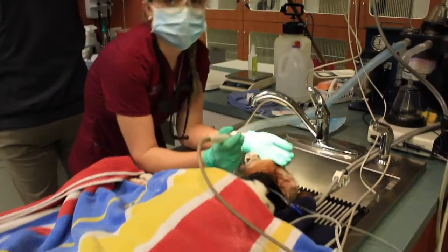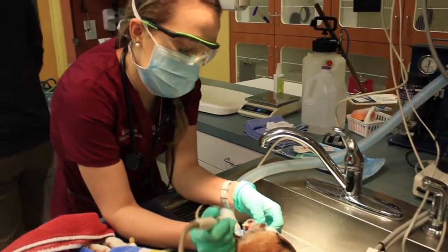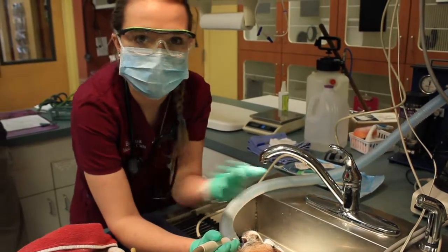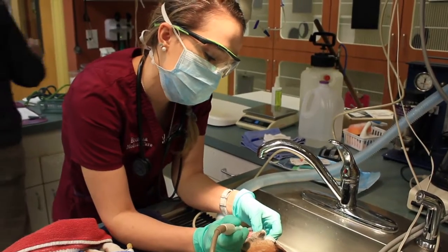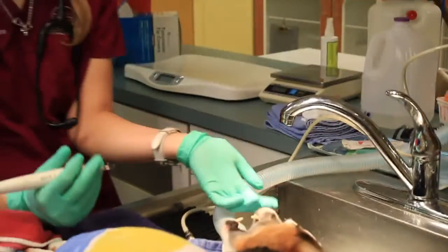I'm scaling each and every tooth just like your dentist would do with you, with an ultrasonic scaler. We don't want to stay on a tooth for more than five seconds at a time because it gets hot and can damage the tooth. We're going to try to get all the plaque and tartar off that we can. We also put gauze in the back of the mouth to help keep water and debris from flying back there.